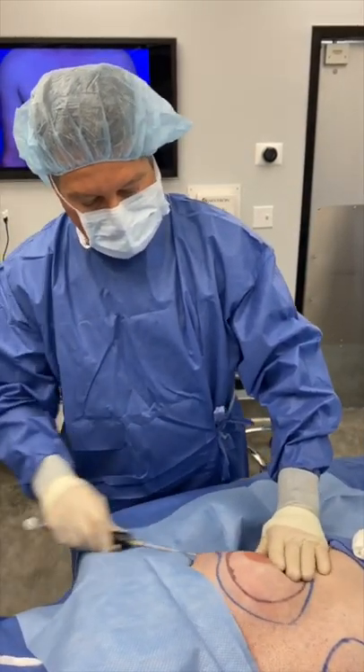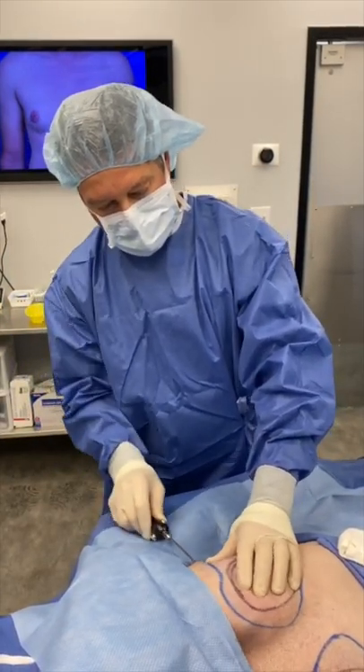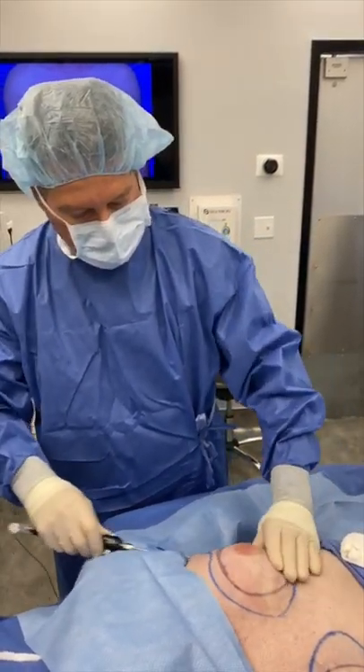For those people who have rather dense tissue, it could be a challenge to move this cannula through. If not, it's important to get underneath and around the specimen.